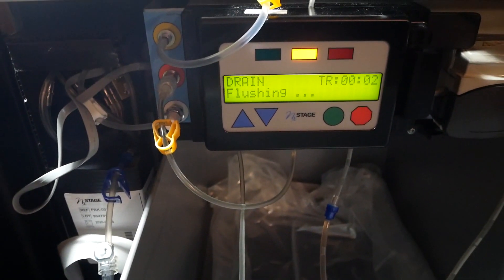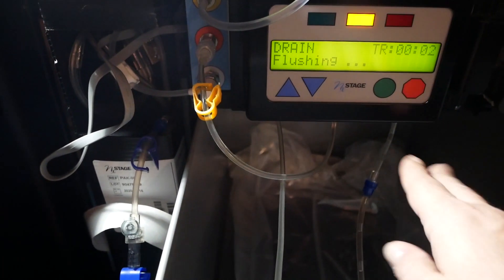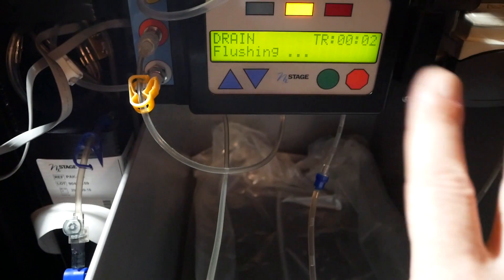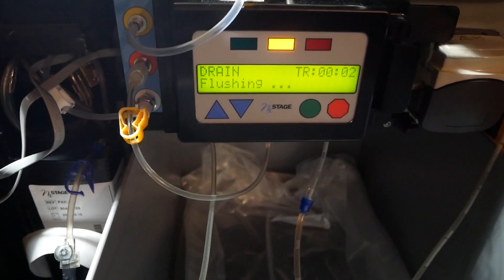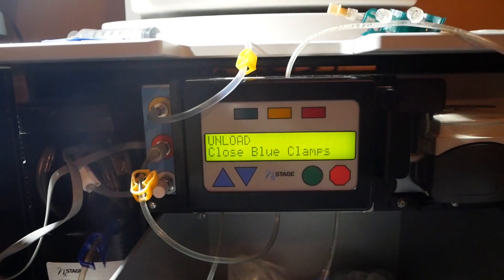Now it says 'flushing.' We don't interrupt this - it takes about two minutes. All it does is take all of the liquid left in the lines in the system and flush that out. We don't want to stop that, we're going to let it do its thing for about two minutes.